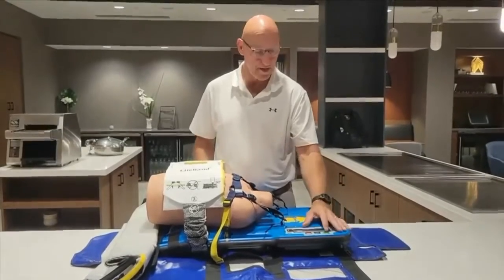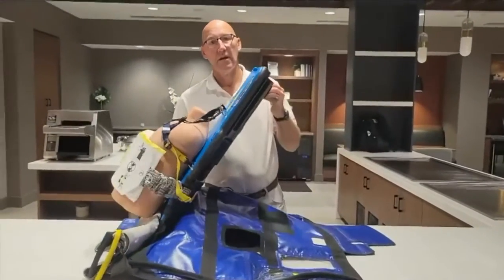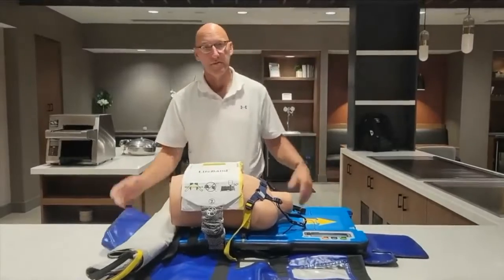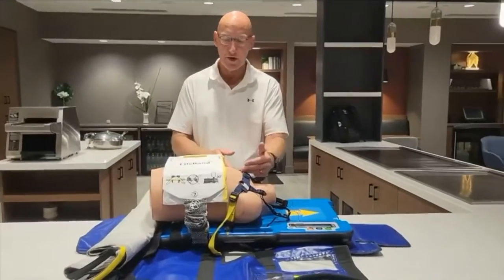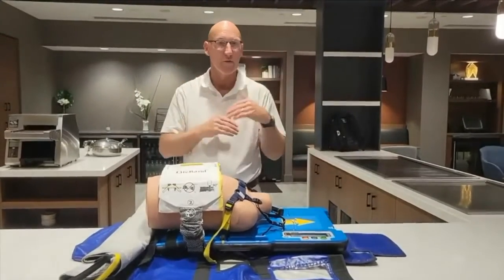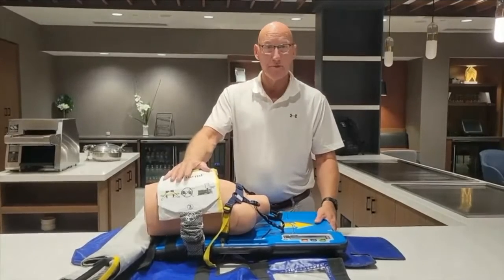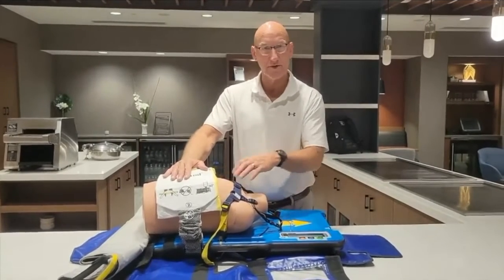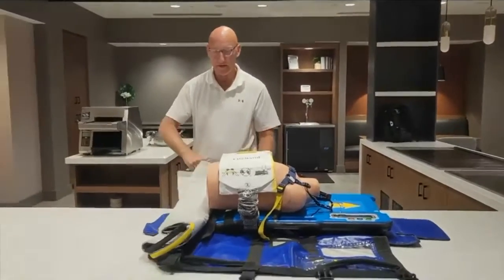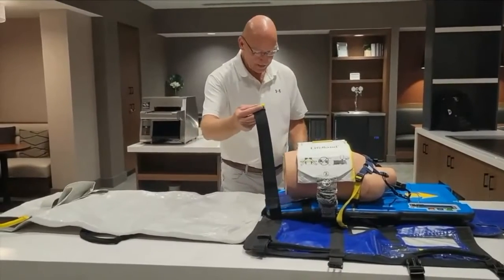The AutoPulse with the quick carry case enables resuscitation on the move. By securing that patient down with the shoulder harness, it allows you to extricate a patient upstairs, downstairs, and around corners. If your department is limited on resources, we can also put this small AutoPulse inside a stair chair to extricate a patient. This quick carry case pulls out underneath the patient, and there's a seat belt that will allow you to secure the patient down on top of the platform. With resuscitation on the move, this quick carry case allows you to twist and turn and extricate your patient.